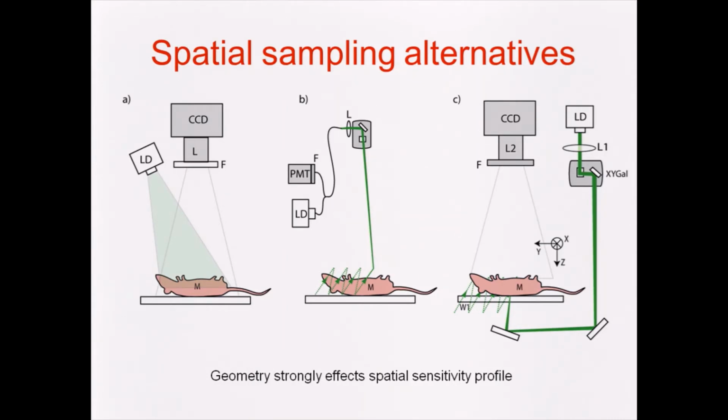And they're both coupled to a pair of fibers up here, and then you relay the pair of fibers down onto a mouse. So this would be raster scanning of a mouse. Or you can combine these two approaches and have a camera viewing the entire surface of a mouse while you laser scan from the bottom of the mouse. And again, as you go this way, they become a little bit more complex, but you gain more information.